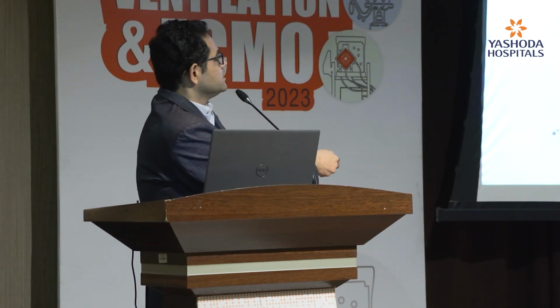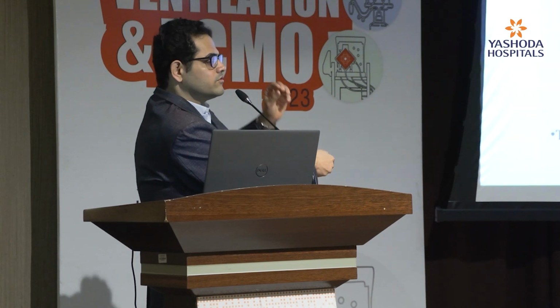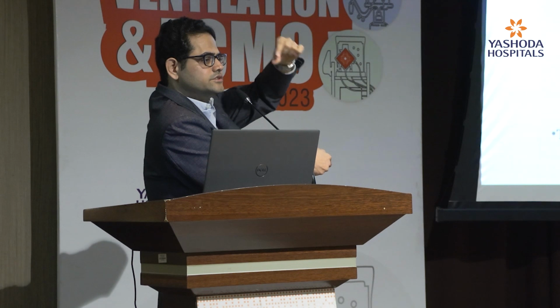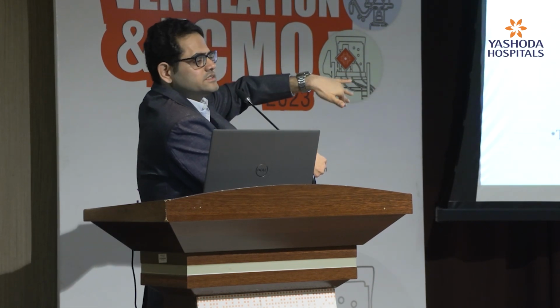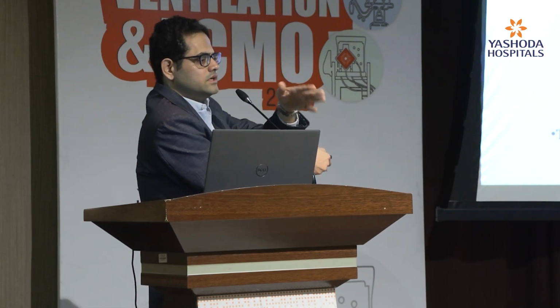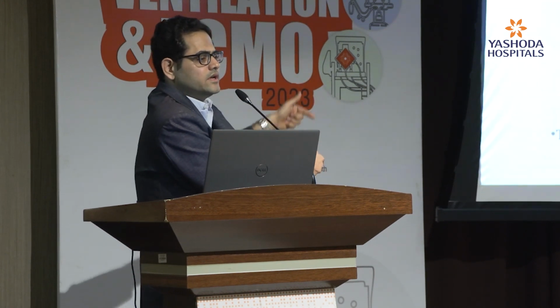So what is happening here? The expiration is not touching. There could be a circuit leak. You have to find out from where the circuit is leaking, or there may be some misconnection, or the ETT suction port has disconnected. So there is some leakage happening. Okay, the cuff might be ruptured, or there is a small hole in the ventilator circuit. So this you have to inspect from the patient end to the ventilator end.